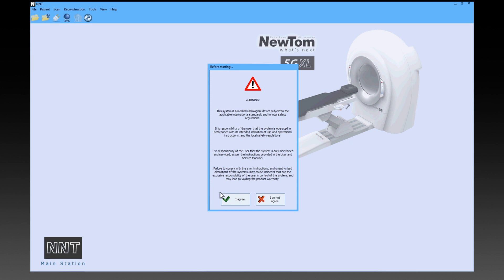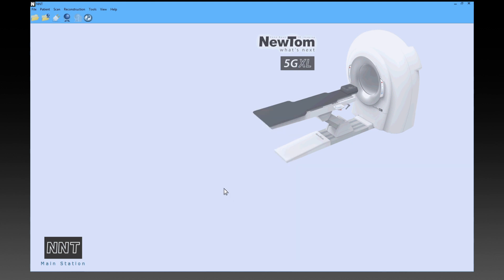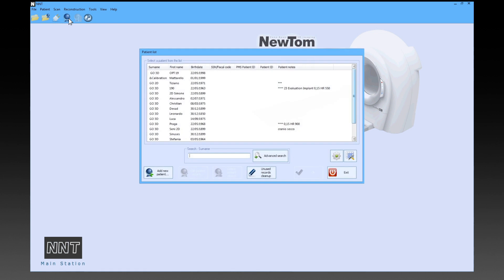After welcoming a patient, her folder can be retrieved from the patient records or a new entry can be made from the special screen pane.